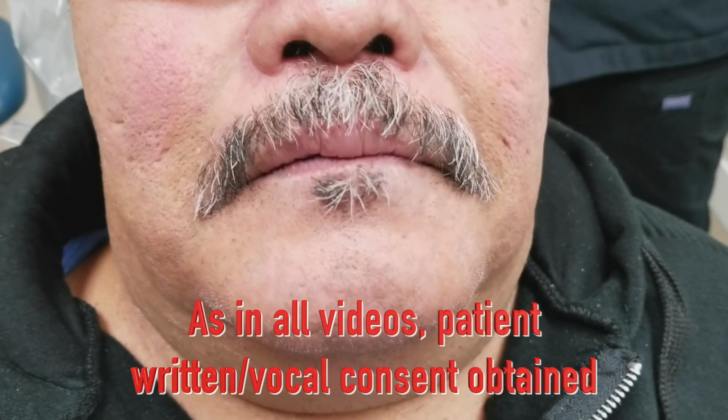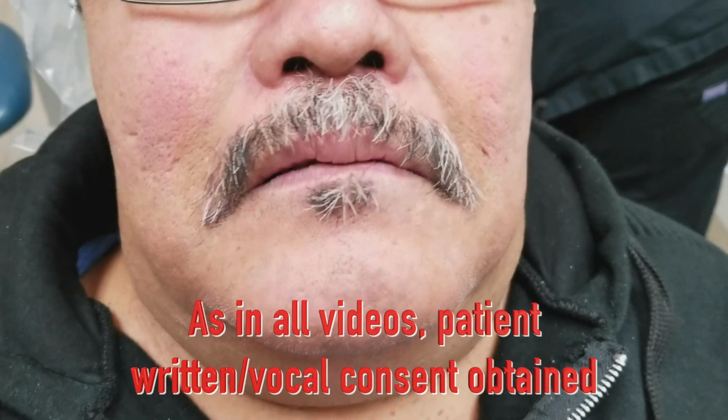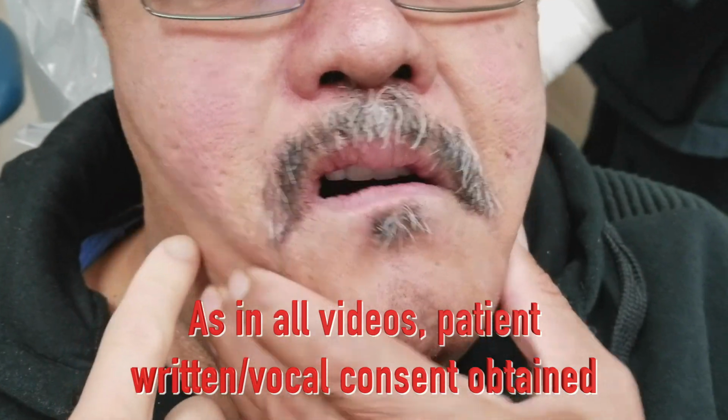Good. Now, do you feel any numbness at all in your lower right? Your lower right? No. Down here. No pain on this side? No. Okay. And open? And then bite down? Okay. Are you enjoying your dentures right now? Yeah, I eat on this side. Okay. But I don't know, it feels like that side feels better. I can bite this side. Okay. Good. Good. Okay.